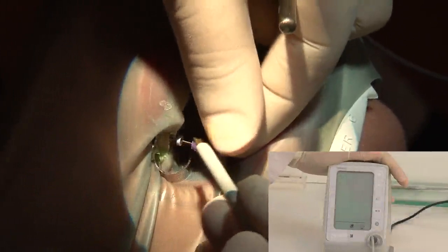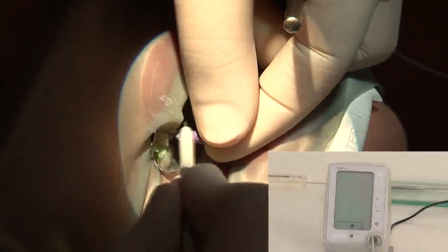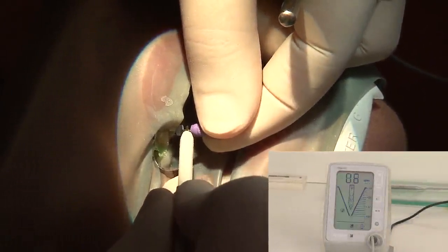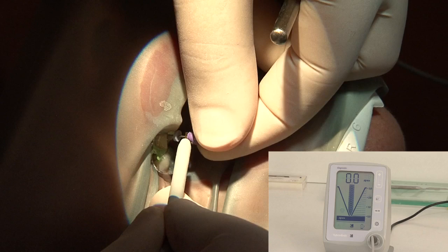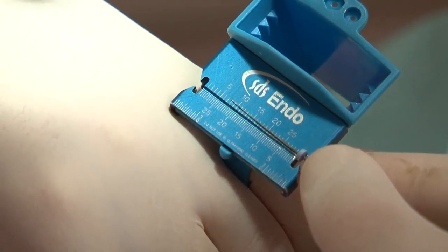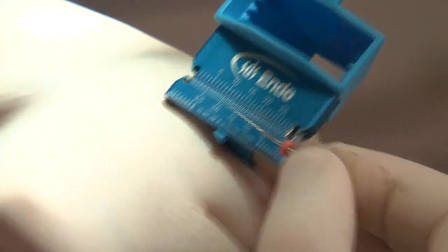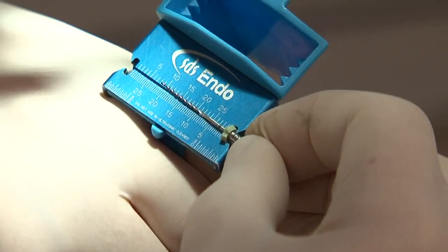The next step is going to be establishing the working length with the element diagnostic unit. A size K10 or K15 file is used. Once we touch the file the element will be activated. We need to go down to minus 0.5 which means that the file is outside the root canal, and then to take it out slowly to the 0.0 level which is going to be our point of reference or our working length. I'm using the palatal occlusal reference or the palatal cusp as a reference for my working length. So the working length is going to be 22 mm for both canals. I adjust my TFs 25-06 to 22 and the 40-04 to 22 mm also.